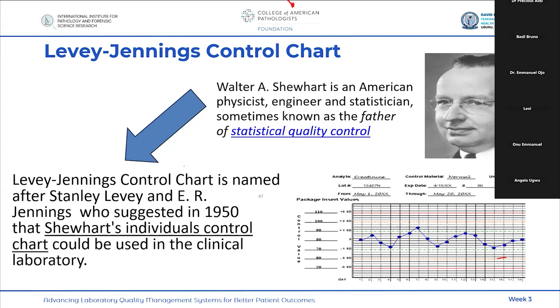And it will even tell you of the rule that has been violated. That's one of the examples I said about AI-powered software. So to answer in a simple way, you use previous data to establish the QC limit. And I hope that is clear.